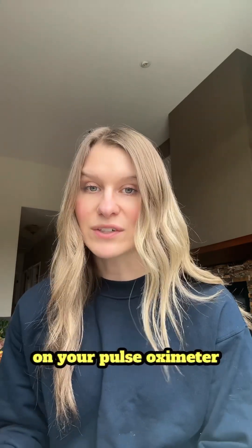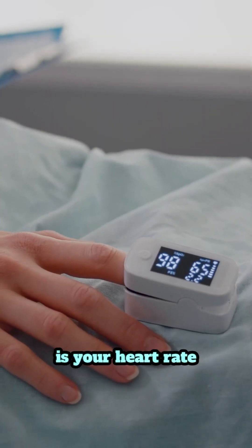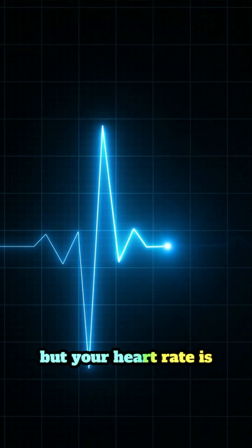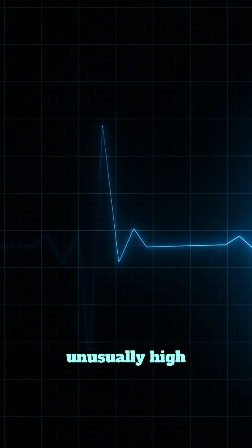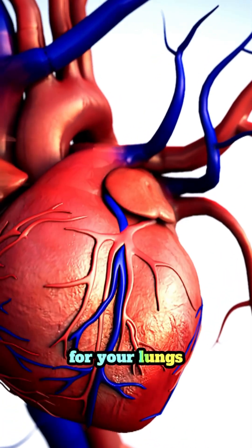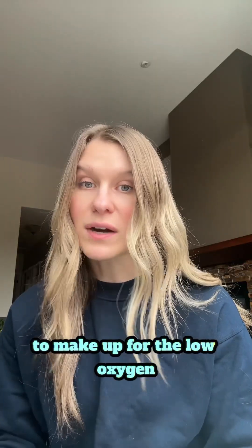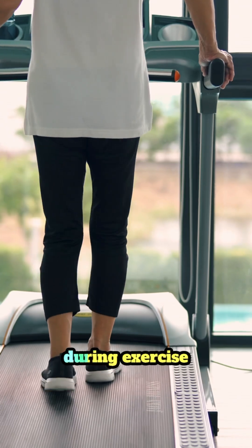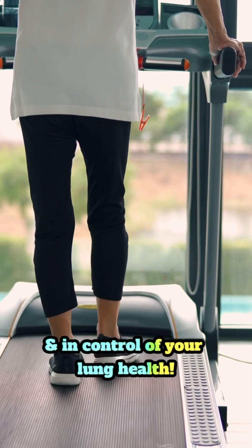Another reading on your pulse oximeter is your heart rate, and this is an important number to also make note of. If your oxygen levels look okay but your heart rate is unusually high, it may mean that your heart is overcompensating for your lungs to make up for the low oxygen. Keeping an eye on both numbers helps you stay safe during exercise and in control of your lung health.